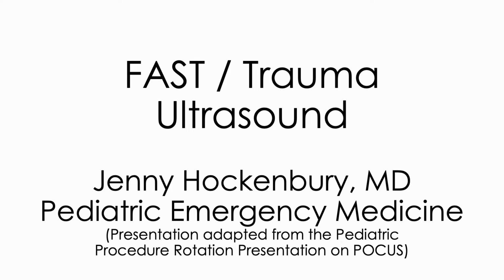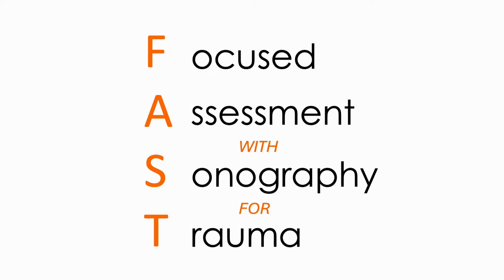Hi everyone, I'm Jenny Hockenbury, one of the Pediatric Emergency Medicine Fellows. Today we're going to talk about the FAST exam in pediatric trauma. Our goal is to understand what we're looking for, how to obtain the views, and how to interpret them in the trauma bay. The exam stands for Focused Assessment with Sonography for Trauma.